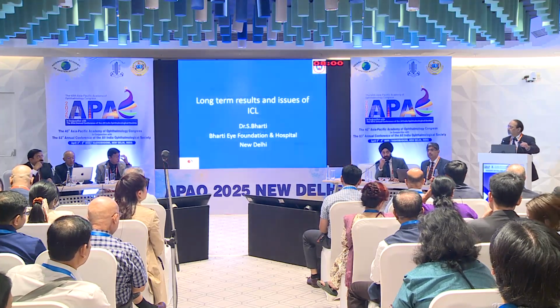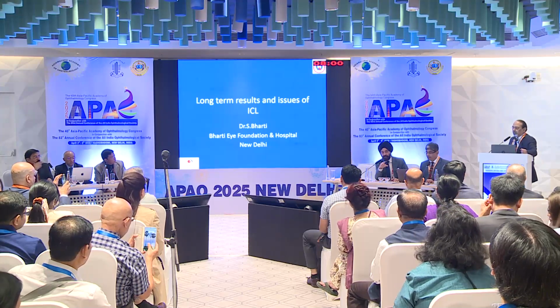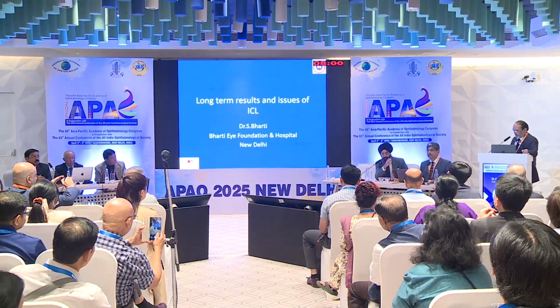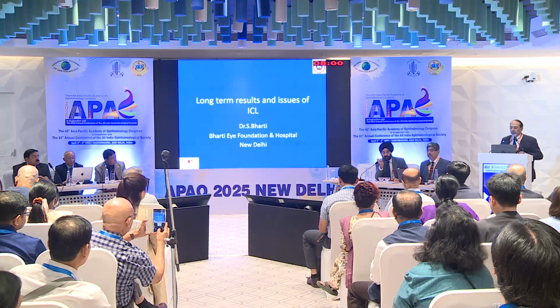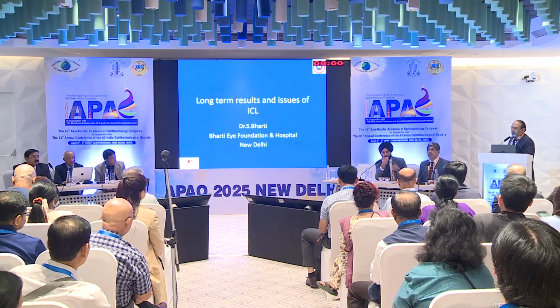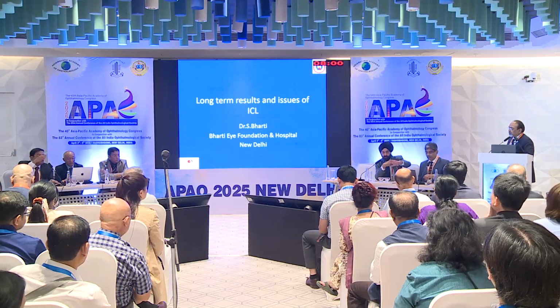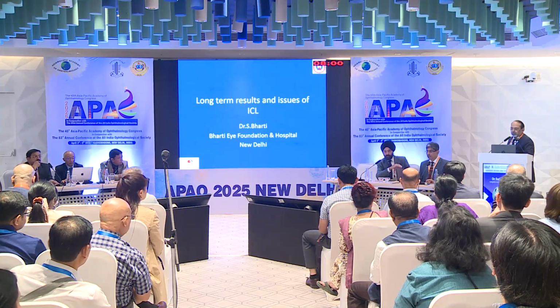See, any other questions from the floor? Things have changed because earlier I used to do a surgical iridotomy. So that is why you needed a small pupil to do a surgical iridotomy. The other biggest advantage is that if you leave the pupil dilated, then in the immediate post-op, before the patient goes, you can actually see the alignment. If it is small, you can't see the alignment, but you can see that the alignment is fine, say at 45 minutes or 1 hour. Normally, the majority of the rotations occur in the first few hours.